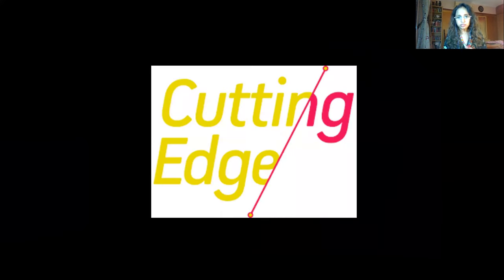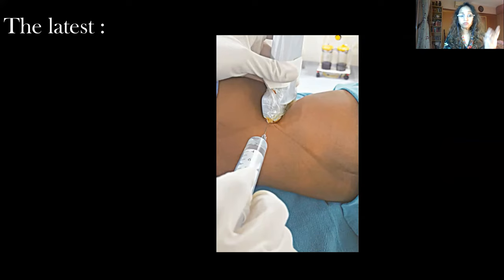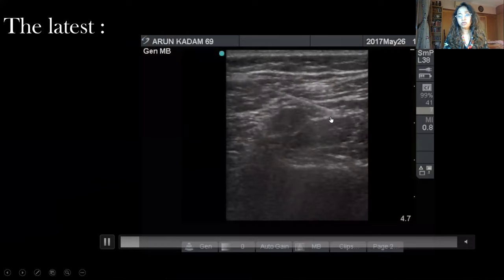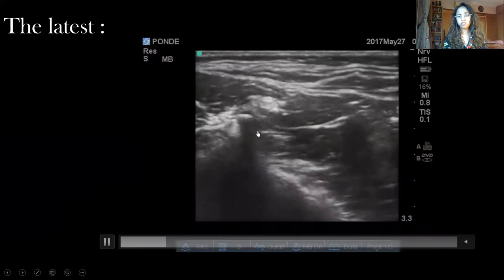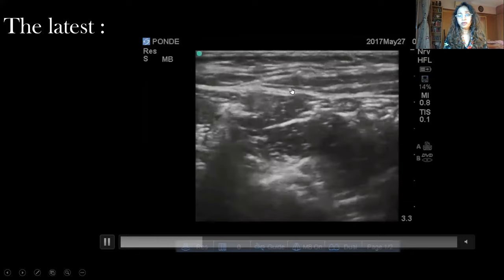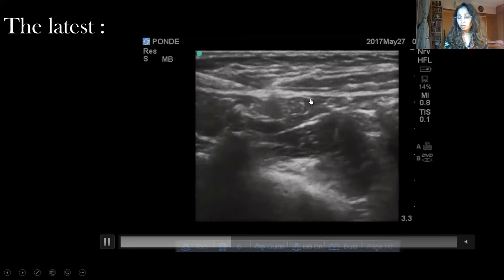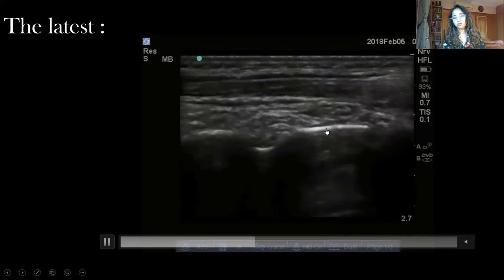Coming to the most recently described blocks in pediatric regional anesthesia, they are as follows. I'm going to run the video through it for you to see. First will be the QL, that is the quadratus lumborum block. The assembly is as follows. So this is the injection done. This is the QL muscle. This is the transverse process and the vertebral body, a bunny rabbit as it were. The psoas is here. This is the nerve root coming out, this is the erector spinae, and this is the QL, and these are the abdominal wall muscles. So you will see the QL2 here, QL1 here. Coming to the erector spinae, these are the transverse processes.